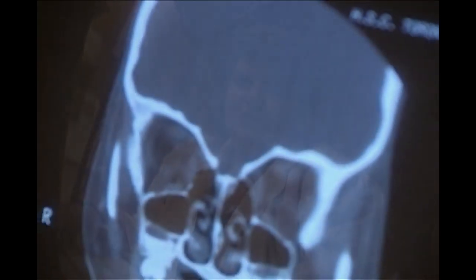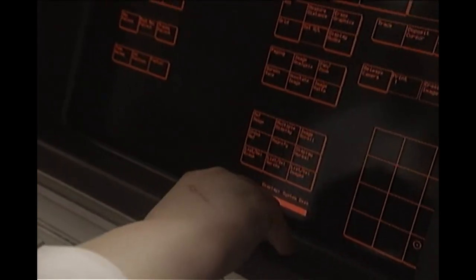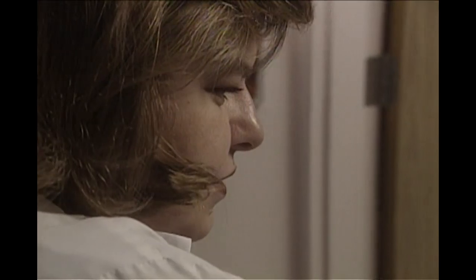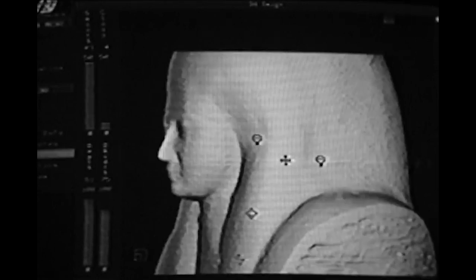Once the meticulous scanning was completed, it was finally time for the mummy to show herself. A computer compiled the pictures into a 3D rendering, but the quality was poor. In living patients, bone is dense and shows up white. Fat, flesh, and skin are gray. Liquid is black. In Jed's body, the bones had lost minerals and become softer, while the soft tissue had toughened. Instead of a high contrast image, Jed was showing up only in shades of gray. This low contrast problem meant that Holoka would have to painstakingly render the images slice by slice.